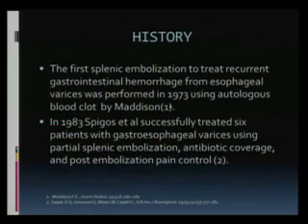This was only one case. This is when it first happened, and they did it with antibiotic coverage and post-embolization pain control. And these are the landmark papers for the history of splenic embolization.